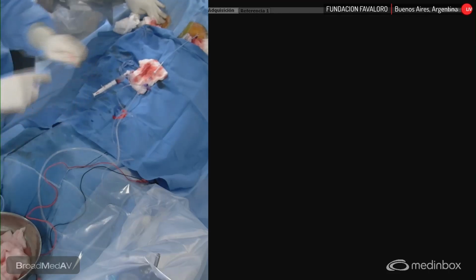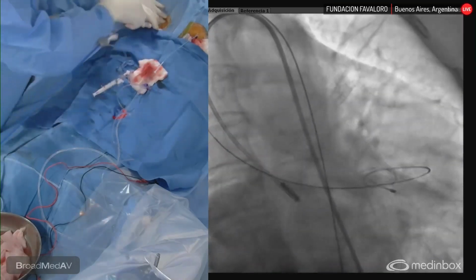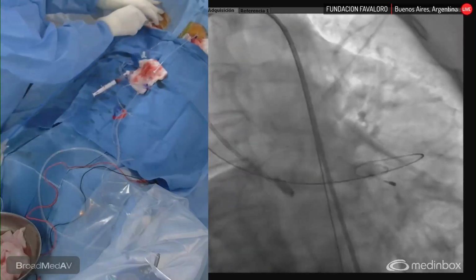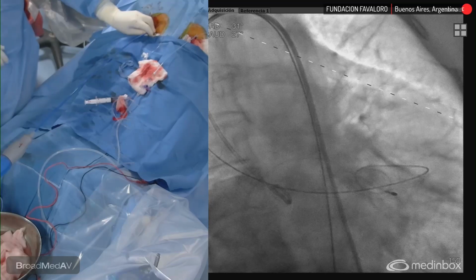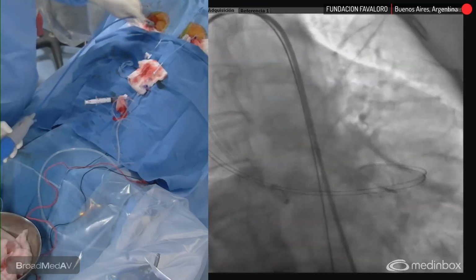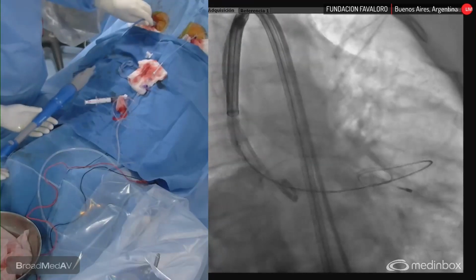Yesterday we did an extremely interesting case because we had a tight stenosis and severe calcification of the common femoral artery. We went a little bit higher, actually at the very top of the femoral head, above this stenosis. But given the calcification a little bit below, we decided to go with the old ProStar, with the stronger needles.